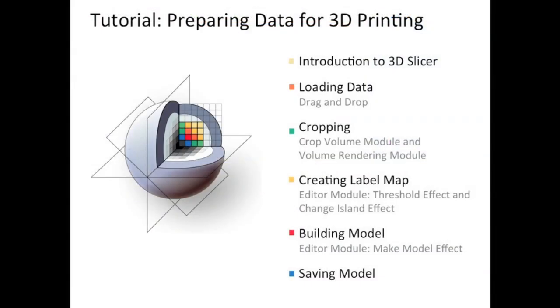Now we've used the crop volume module to crop down the cone beam CT, so we can go ahead and create that label map in the editor module, in which I'm going to segment out only the bone part of this sub volume. To be clear, in Slicer when I say label map I mean a 3D scalar volume in which each of the voxels is a number, and that number indicates the type of tissue at that location. All these label volumes are associated with a color node that maps the numbers into colors and text strings. In this case I'm going to create a label map with basically three numbers: zero for the background, and then two other numbers to delineate the bone — one for the temporal side of the TMJ and the other for the mandibular portion.